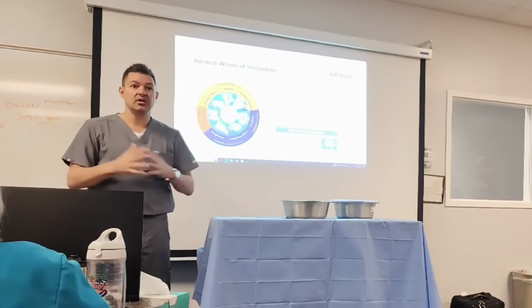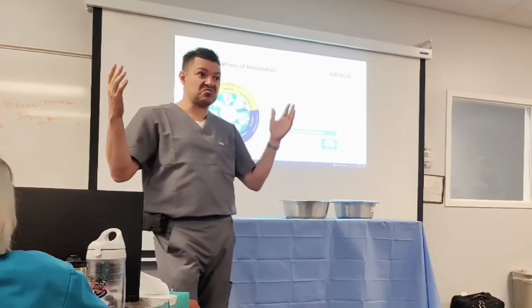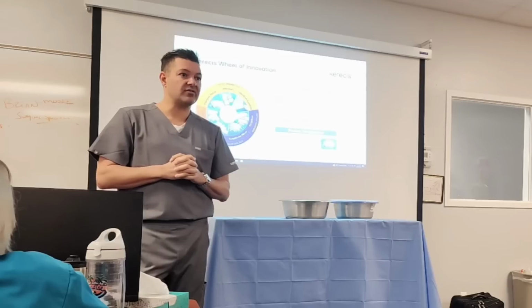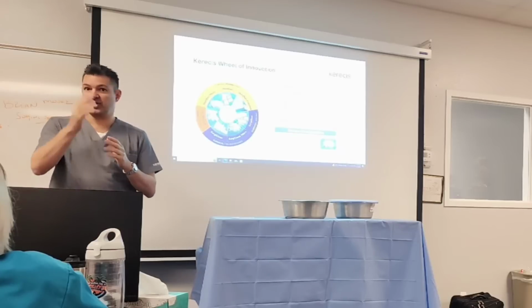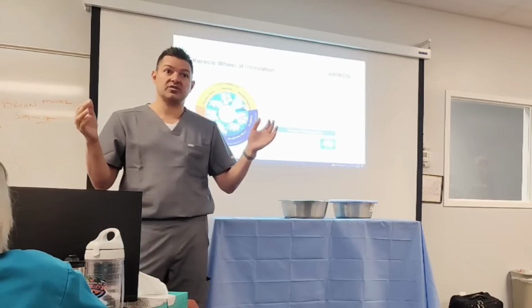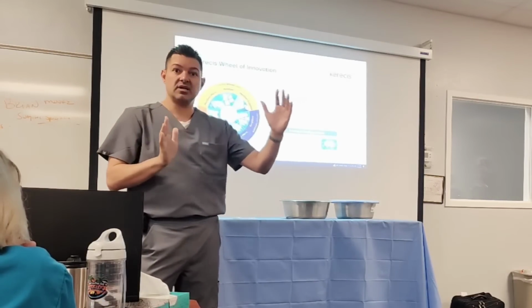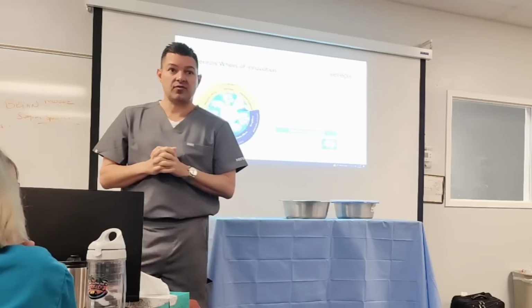But the expansion, we have 300 square centimeters meshed that go up to about 450, 500 square centimeters. And we have all the way down to a product that would be like a solid of a 1.75 by 1.75. So a real vast difference in sizes. But for the coverage aspect, I've done a burn patient where we used 3 of the 250 square centimeters and covered the entire back. And the nice thing is you can cut this to manipulate and just strategically place the different fish skins to fit the anatomical structure that you're trying to achieve for healing.